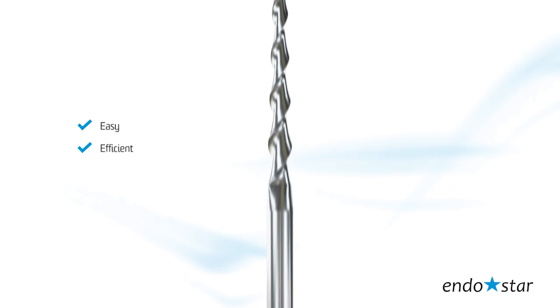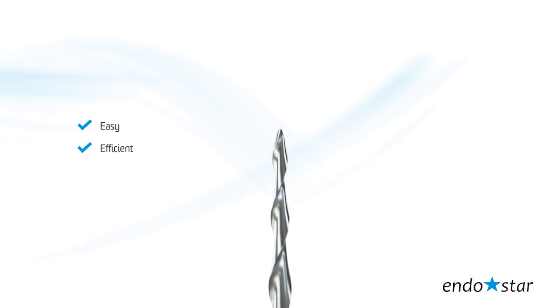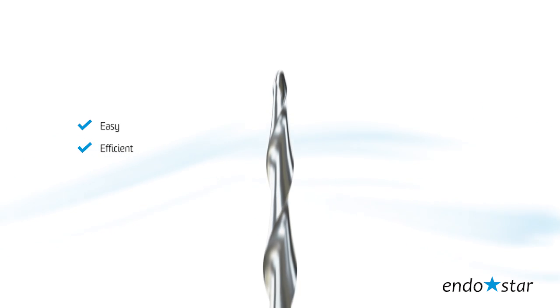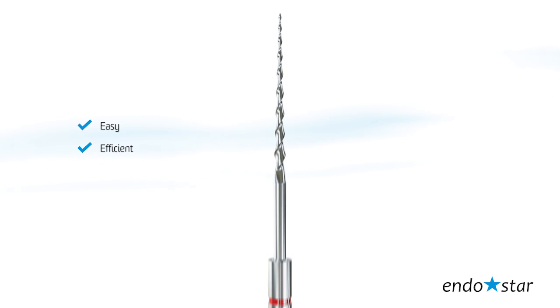Efficient. The efficiency of the EndoStar E3 system comes from the possibility to adapt even to the most curved canals, thus minimizing the risk of perforation. The proper shape ensures efficient cutting of dentine and removal of dentine shavings from the canal.